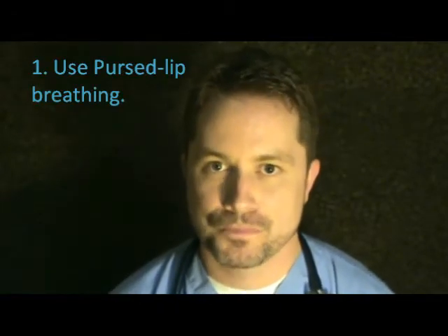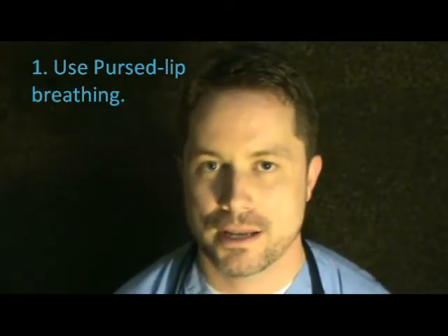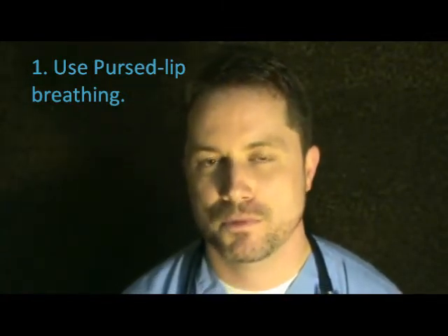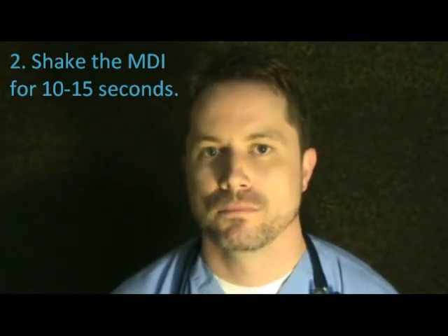One thing you've got to do in preparation for your inhaler is start using pursed lip breathing before the treatment, a couple minutes before, when you're preparing to take it. Just breathe in through your nose and out through pursed lips. Blowing through pursed lips will cause a back pressure to go down into your constricted, swollen airways and help splint them open, so you can exhale all that stale, trapped air out. That way you can take deeper breaths, breathe a little more effectively, and get more medication down into the lungs. So as you're getting ready to take your treatment, do pursed lip breathing.